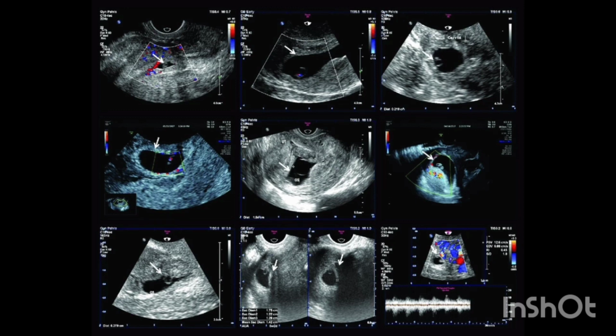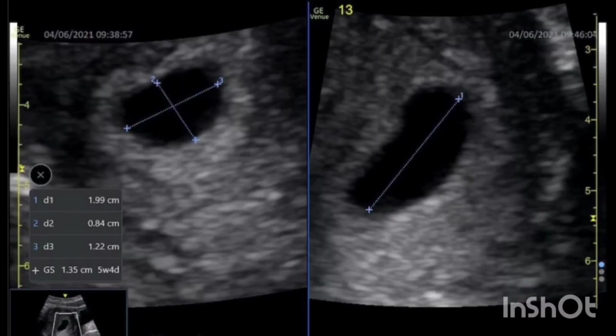The gestational sac is an echo-free space containing the fluid, embryo, and extraembryonic structures. The sac is measured inside the hyperechoic rim, including only the echo-free space. The gestational sac is imaged first in the longitudinal plane, obtaining long axis and anteroposterior measurements perpendicular to each other. Then, in the transverse plane at the level of the anteroposterior measurement, the width measurement is obtained. The three measurements are averaged to obtain the gestational sac mean diameter.